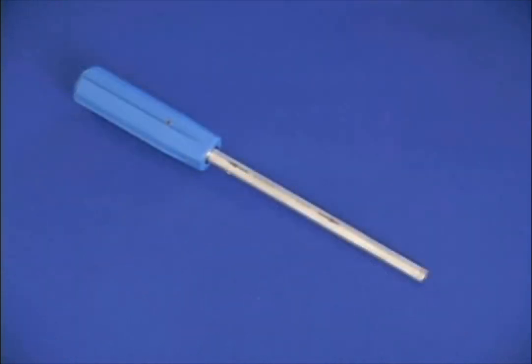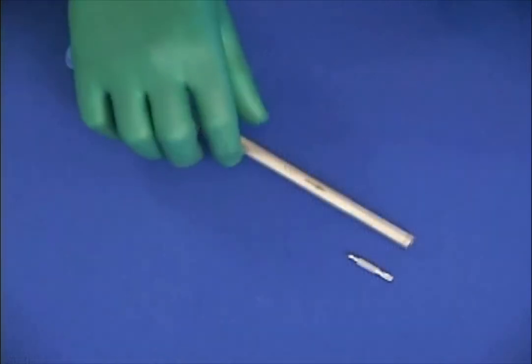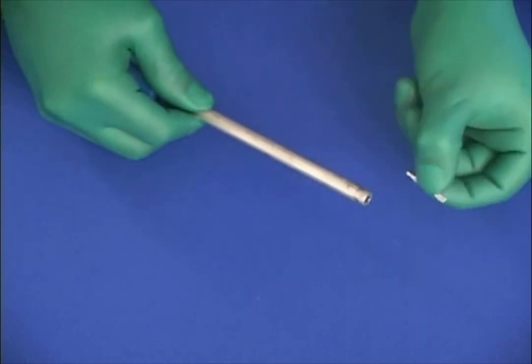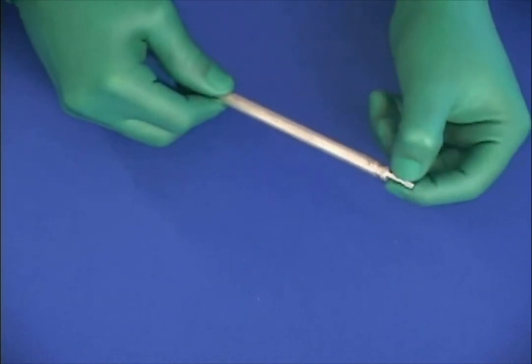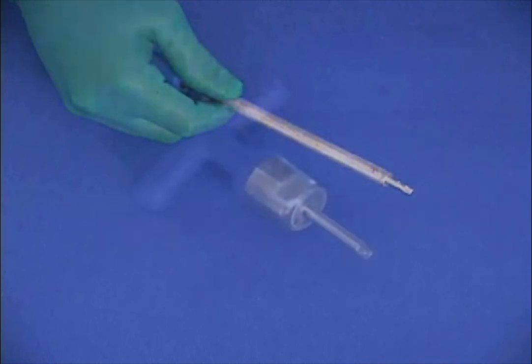The torque screwdriver is utilized for insertion of the pedicle markers, provisional tightening of the set screw of the locking caps, and in conjunction with the torque limiter, final locking of the construct. Replaceable tips ensure the integrity of the final locking instrumentation in each case. Replaceable tips are loaded into and released from the torque screwdriver by pulling back on the outer shaft of the driver. Releasing the outer shaft of the driver locks the tip into the instrument for insertion.